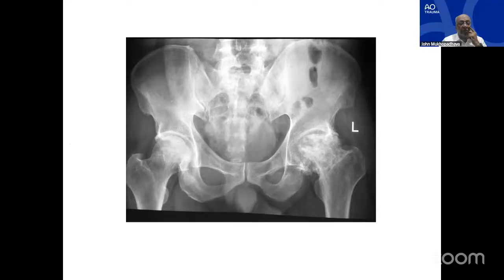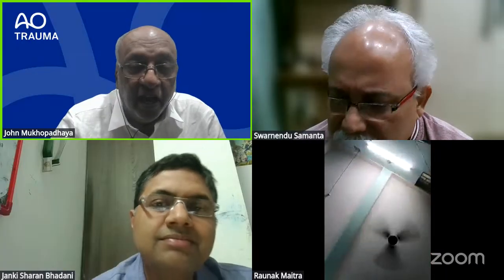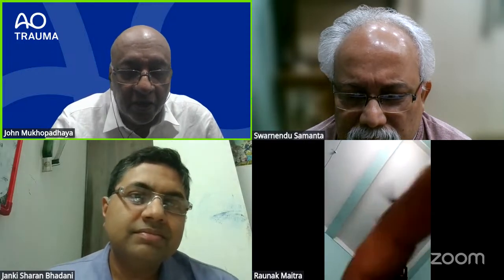No, that was very good in terms of what people should be learning. I think what is clear is that now hopefully they know how they should present an X-ray once they are given that in the exam. So you don't start going straight to the diagnosis. Explain what you see in terms of what X-ray it is, whether you think it's a mature skeleton or an immature skeleton.